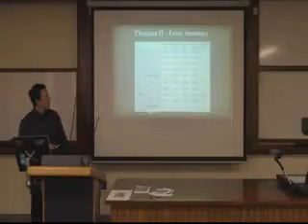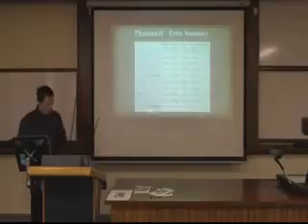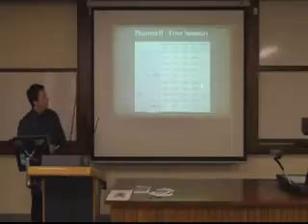And then another imaging run of Phantom 2 with a bone surrogate, that was just aluminium placed within the image, to account for, because in a clinical situation you're going to have bones, and it's going to come up in the image. And in a lot of other studies, that's proved a problem with the presence of bone within there. And it basically didn't change the results very much at all.